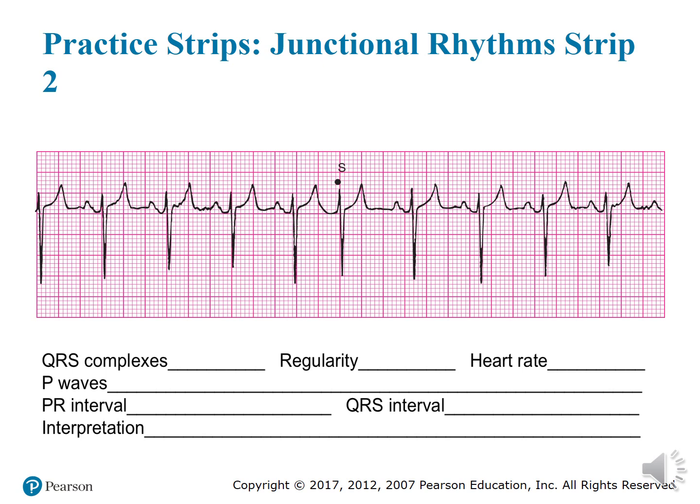Are they wide? Well, in this particular rhythm, we wouldn't say that they are uniformly shaped because some of your S waves are shorter than others. But they are narrow. So we would say QRS complexes, yes, and they are narrowly shaped. Regularity based on this rhythm would be regular with a premature beat, where the premature beat is happening right here.